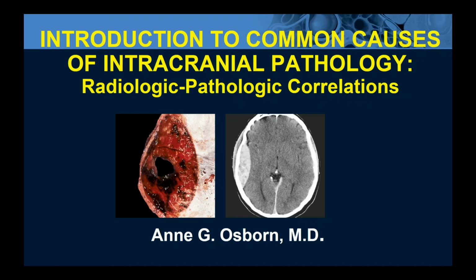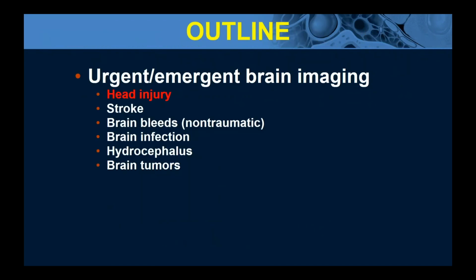Whatever I'm going to show you, where it's possible, I'm going to show you what it looks like at a surgical or an autopsy case, so that then you can see from one to the other what it looks like in pathology and what it looks like on imaging. We've got two back-to-back lectures, and we're going to go through number one, then we'll have a quiz at the end, and then we'll go to number two. And I'm recording while we do it.